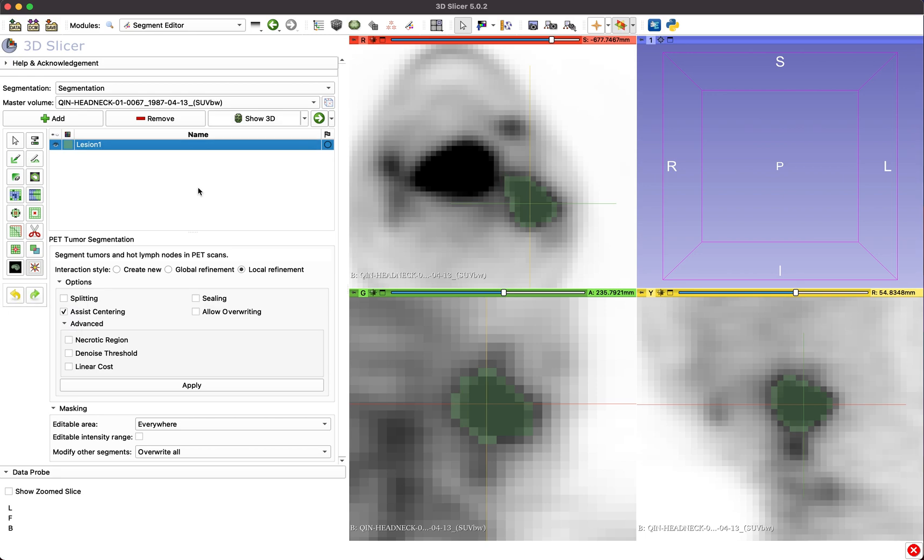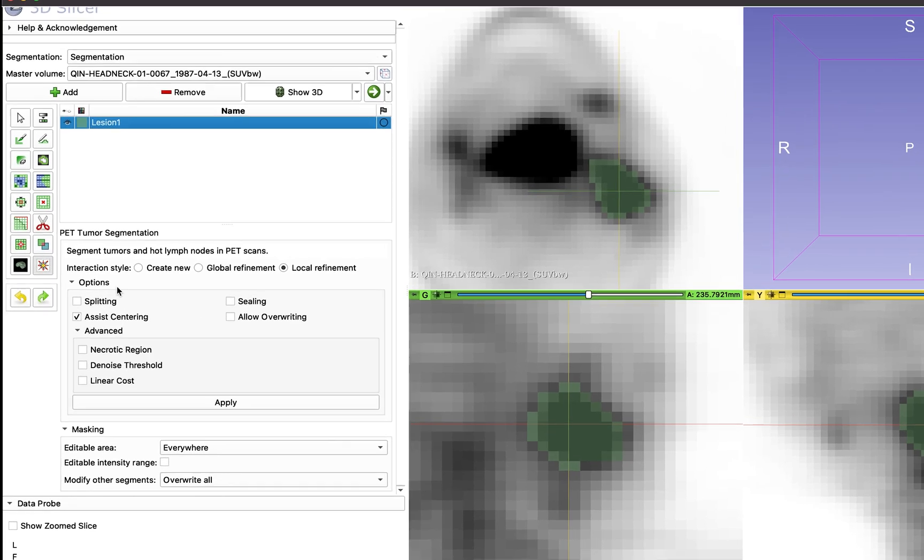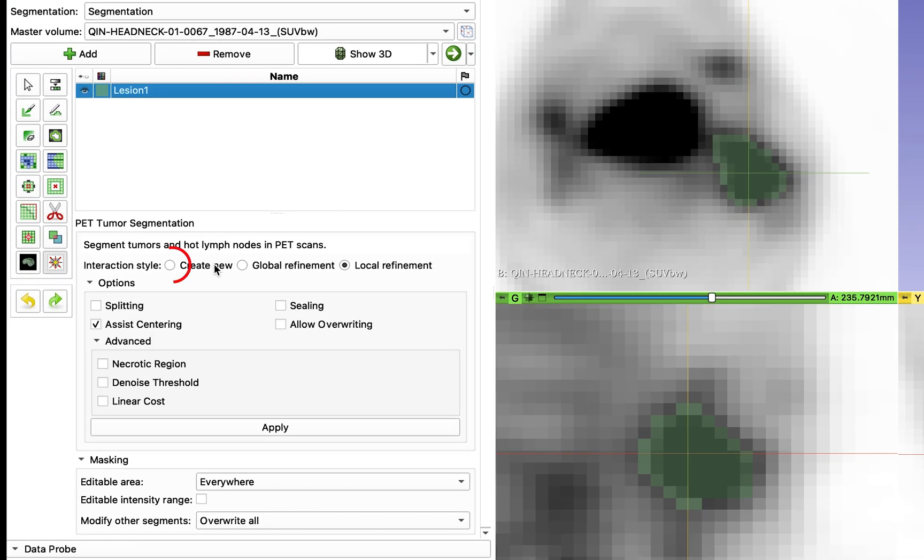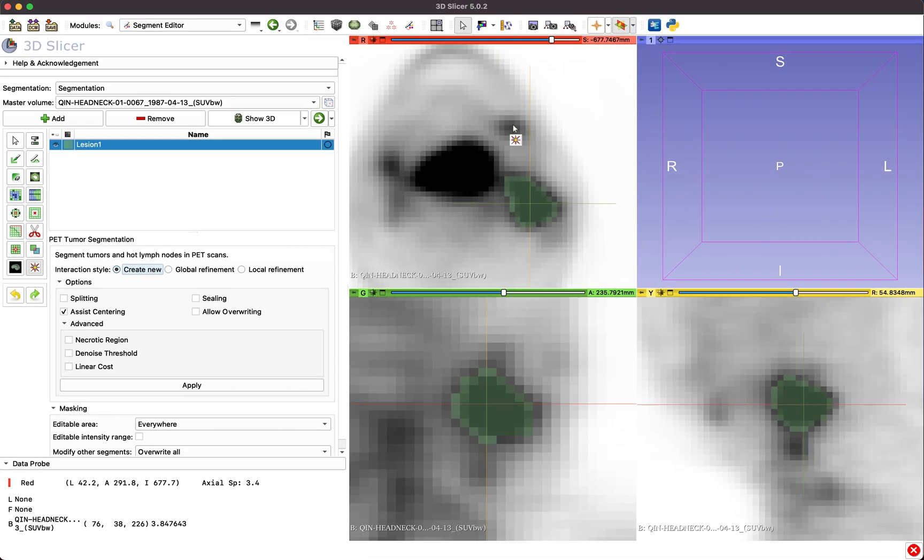To simply create a new segmentation region with the same label, select Create New and click approximately at the center of the new region to segment. All interaction styles can be applied several times until the desired segmentation result is obtained.